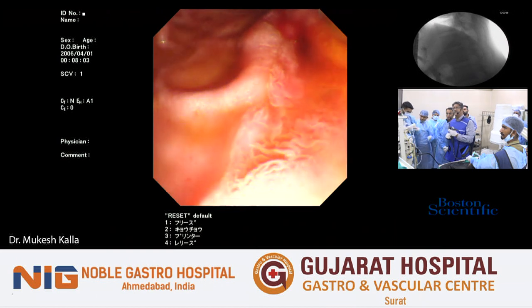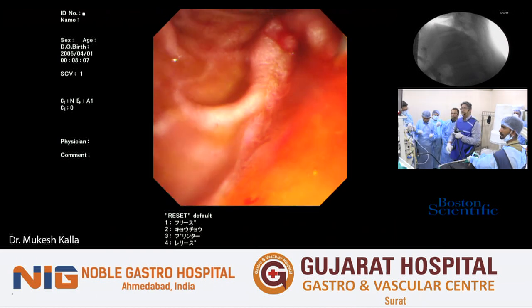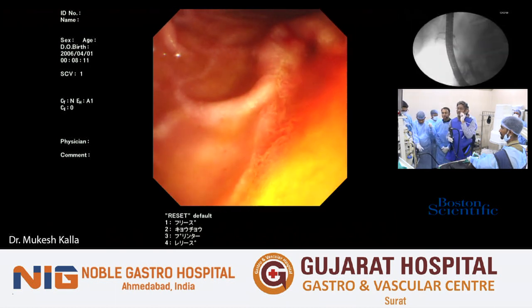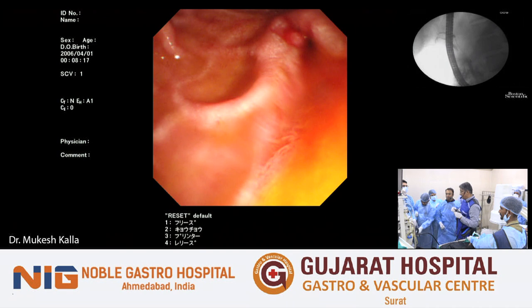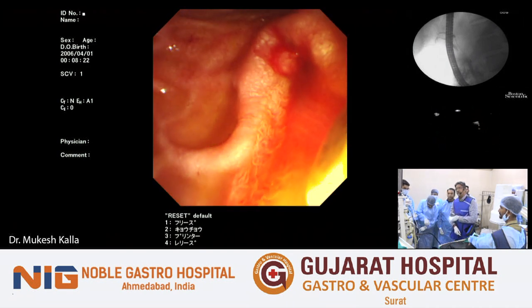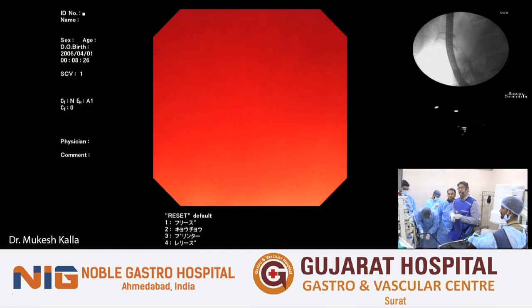We were lucky that we didn't need to struggle too much in the cystic duct manipulation. And Somil did the best job of holding the stone with the SpyGlass basket and brought that stone out. So here I will again take Nilay, when you are doing a Spy cholangioscopy, is it a single operator or do you use an assistant? I do single operator. All right.